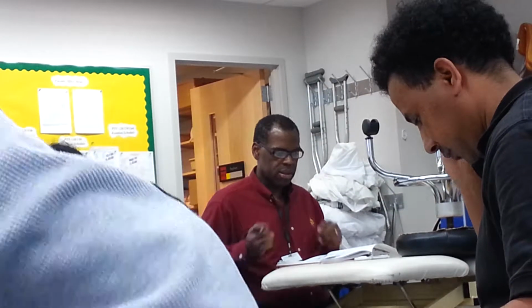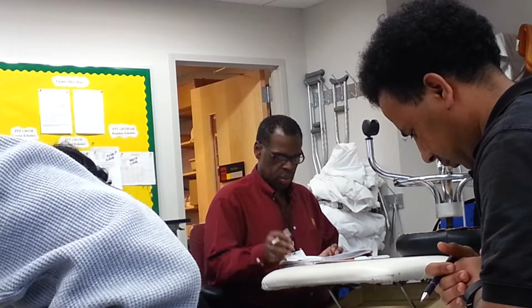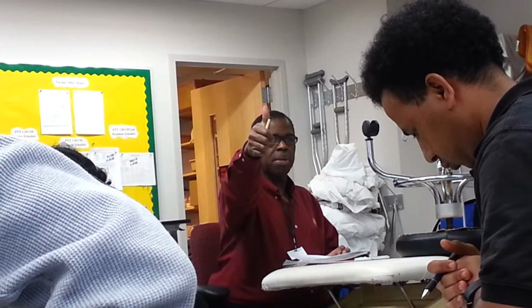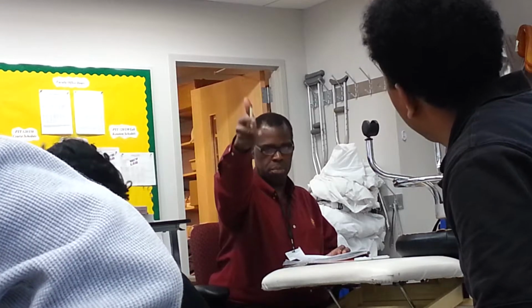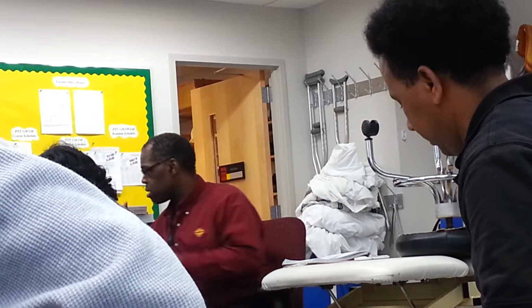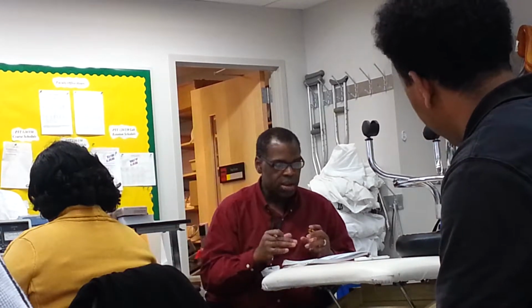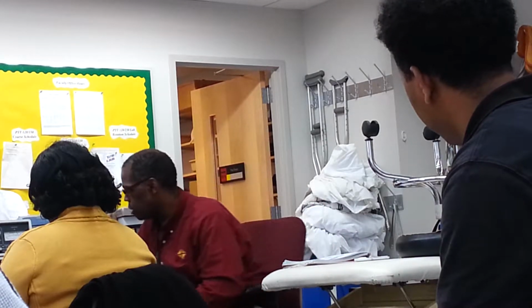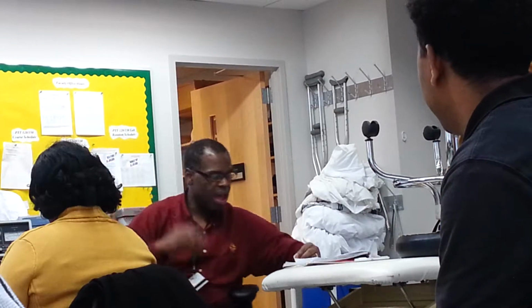All right, so we looked at waveform. That talked about positive or negative. The waveform is either positive or negative or both. In this case, monophasic is either positive or negative. So we know what a monophasic machine is. Then we had to go find one. All right, I see it. I got one. Then we had to get an electrode set up. So I pull out the leads and I put one small and one large. Now I got it on the patient and I got my parameters all set up.